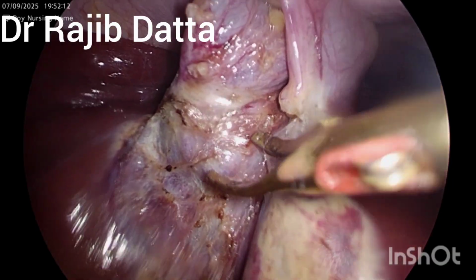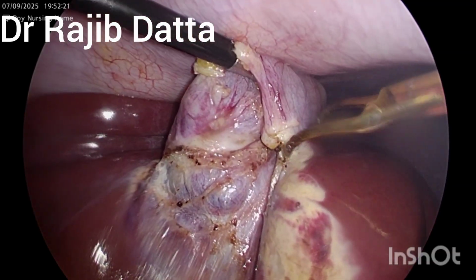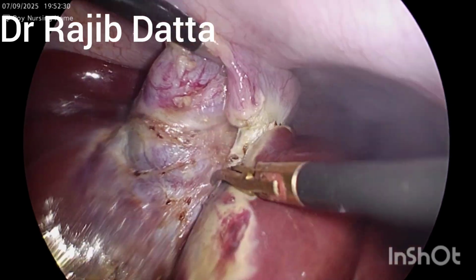Sometimes the gallbladder may be opened up, but it will be manageable. It is better to open up the gallbladder rather than to open up the liver. So it's a dictum.